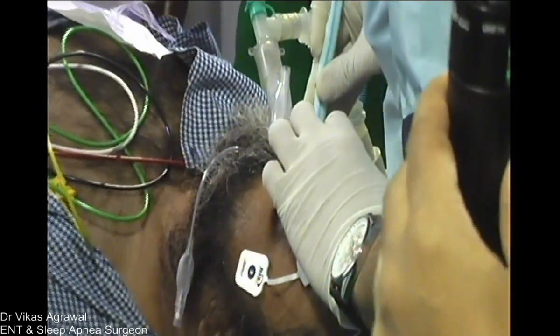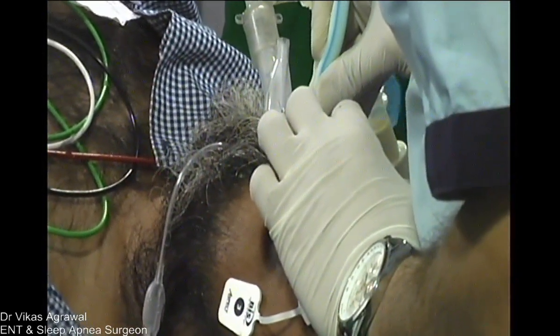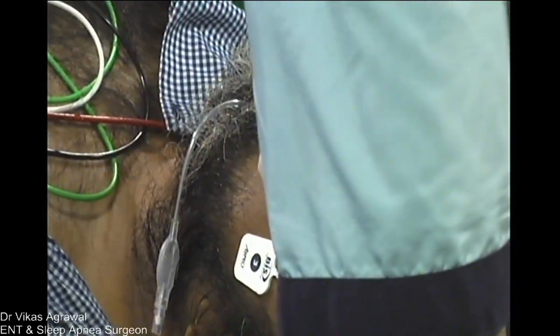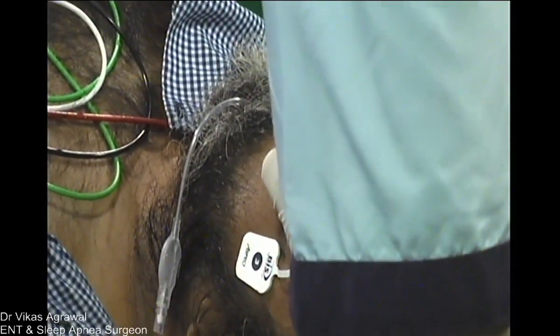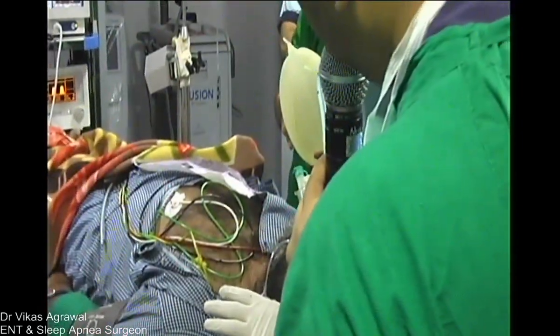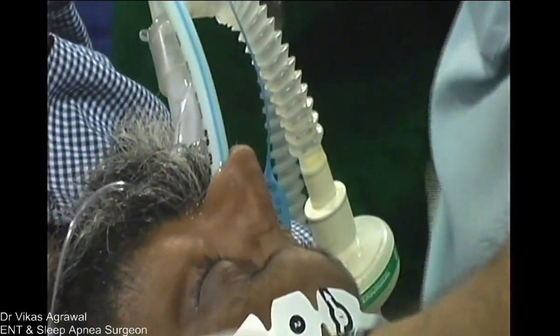And before intubation, we have to be... Okay, suction is ready. What size tube are you going to put, Kalpesh? Actually, he is fit for number 9. Putting one size, one diameter low. Correct. So he is trying a tube of number 8, as you can see there. If this is also difficult, then we can try number 7. I think 8 has already gone in.